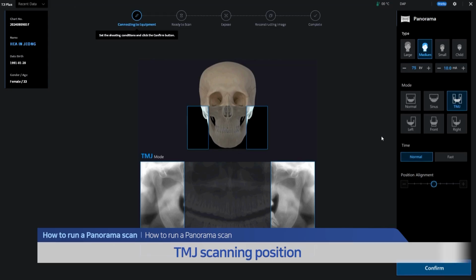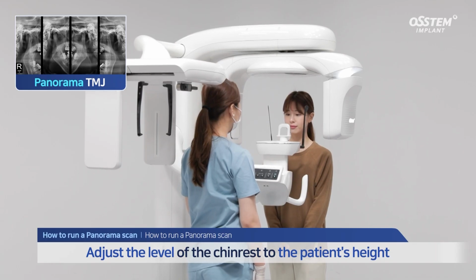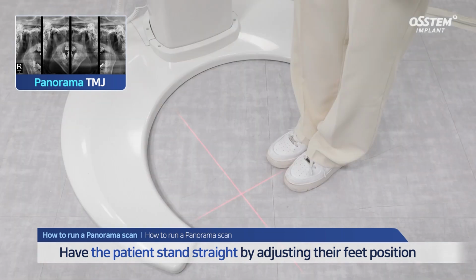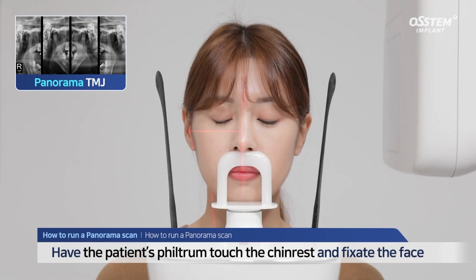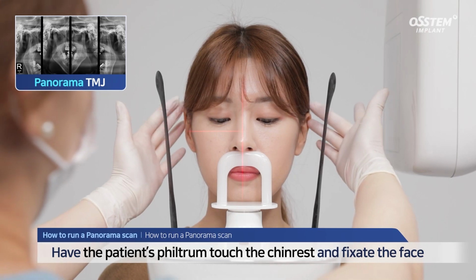Let's take a look at the TMJ scanning position. Adjust the level of the chin rest to the patient's height. Have the patient stand straight with their feet in a comfortable position. Instruct the patient to hold the handles under the chin rest. Have the patient's philtrum touch the chin rest and fixate the face.